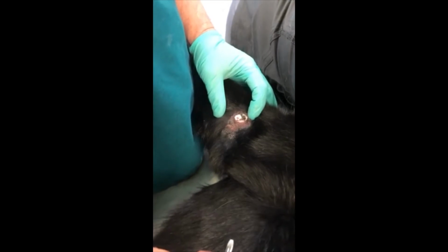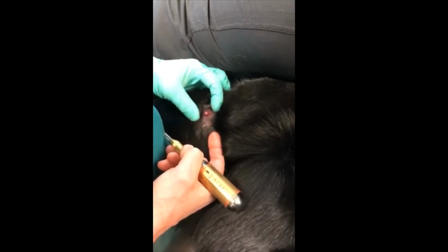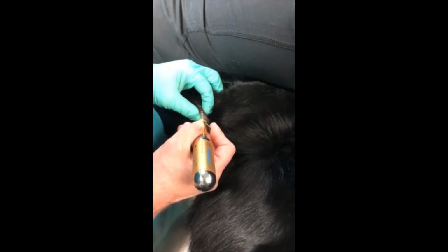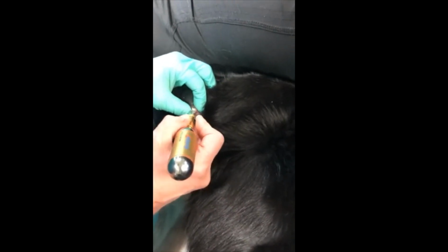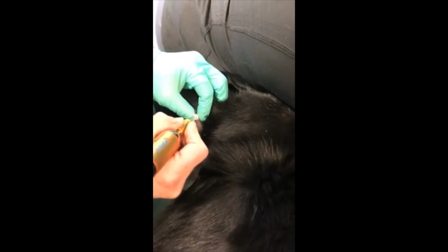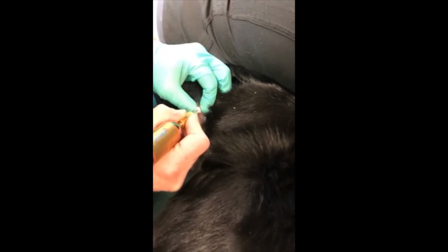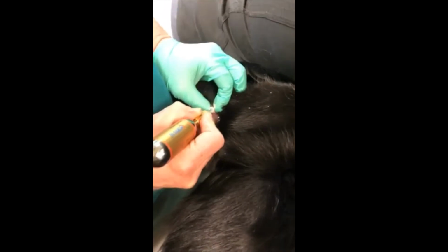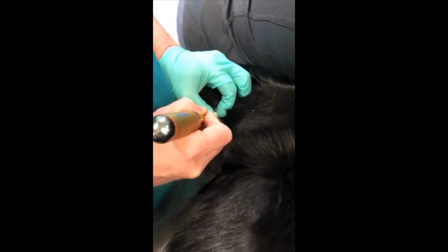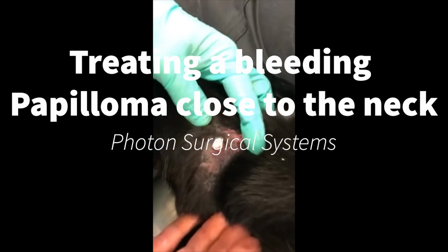Now we're going to let it thaw. Not uncommonly after the thaw cycle, the lesions are a little erythematous. Sometimes they're injected. We're going to go ahead and freeze this again a second time. Same procedure, trying to knock away any ice crystals that may form so that we get gas contact with the lesion. I am wearing gloves this time, and I did use a little lidocaine because this dog is a little fractious. And that's what it looks like following the second freeze cycle.